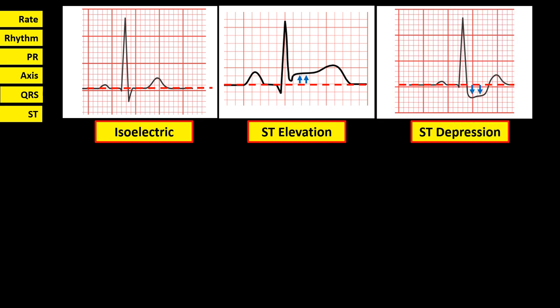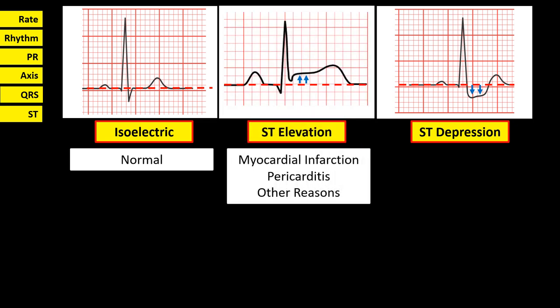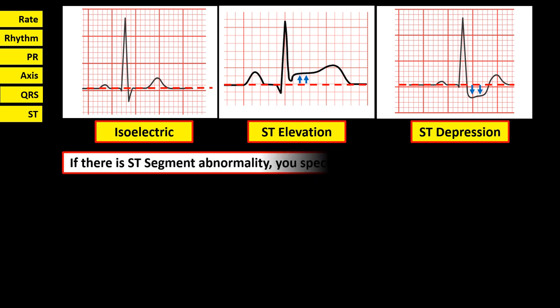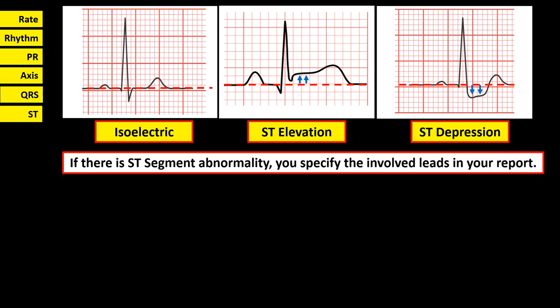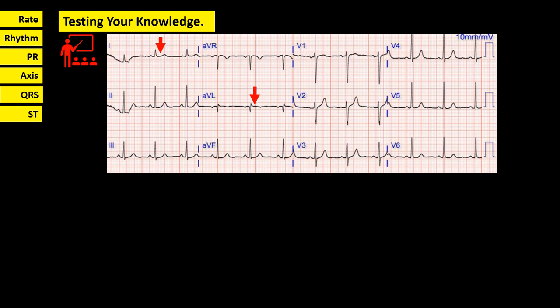After the QRS interval, the next step is to determine the ST segment — a short segment from the end of the S wave to the beginning of the T wave. ST segment can be reported as isoelectric (normal), elevated, or depressed. ST elevation might indicate myocardial infarction, pericarditis, and other reasons. ST depression might indicate myocardial ischemia, electrolyte imbalance, and other reasons. If any ST segment abnormality is found, specify the involved leads in your report. For example, in this tracing, looking at leads 1-AVL, 2-3-AVF, AVR, V1-V2, V3-V4, and V5-V6, there are neither elevation nor depression, so report ST segment as isoelectric.